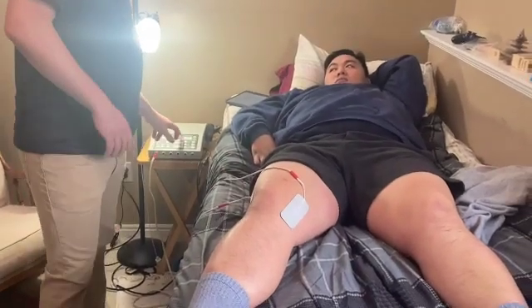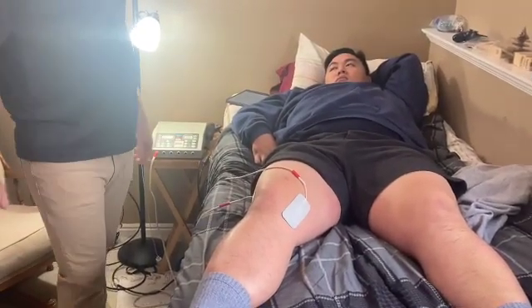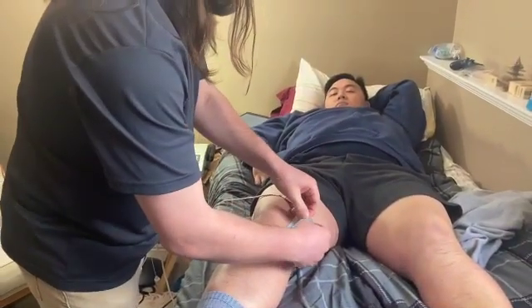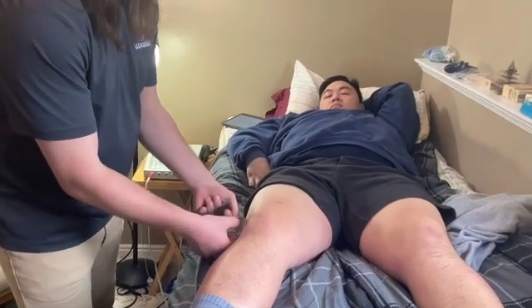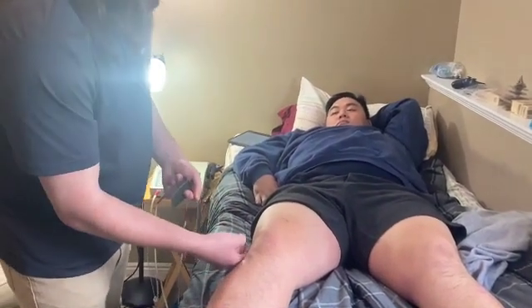All right. So we're going to take you off of the treatment here because we finished up the video. And we're going to double check your skin. Make sure that there's no redness or any sort of irritation underneath. And yeah, we're looking good.